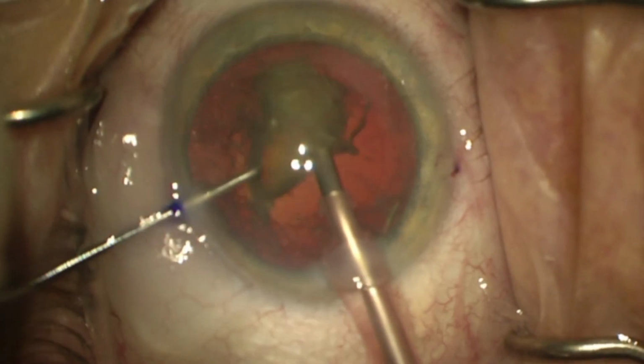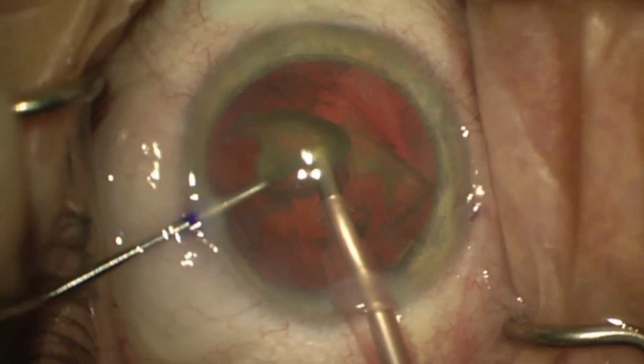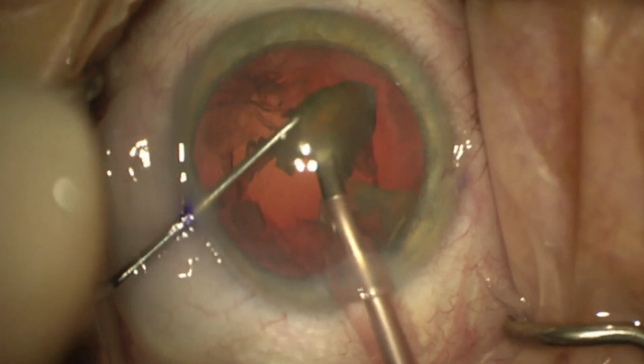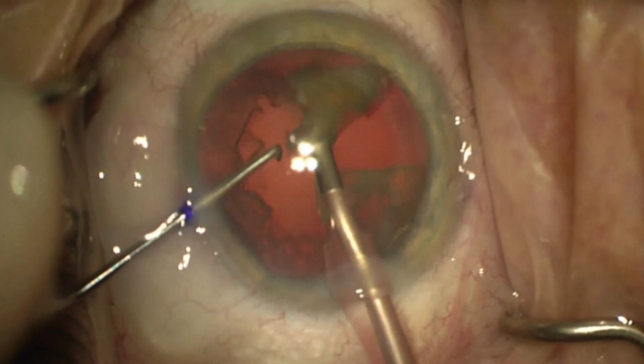Here is near the end of the case. What you want to see here is that you are phacoing in the center. This is the safest part of the anterior chamber, away from the capsule and away from the cornea.